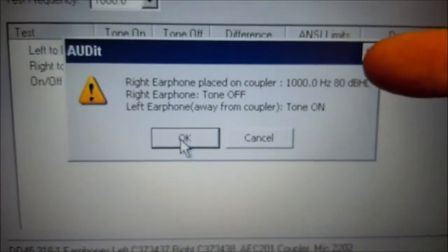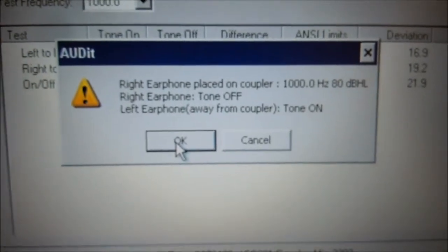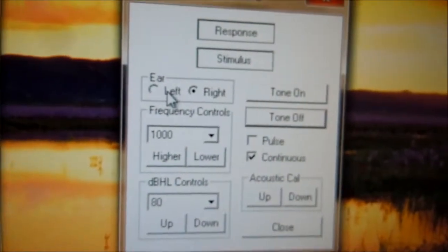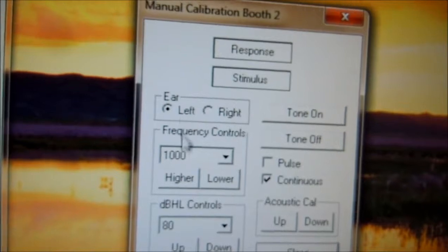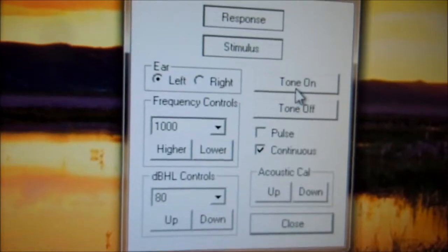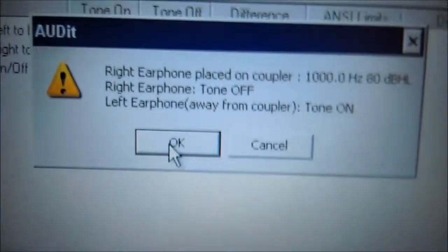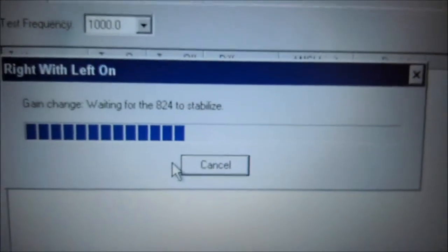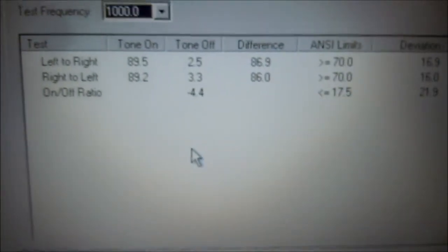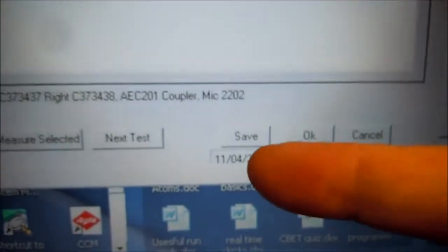We're going to make sure the right ear is on the coupler at 1000 Hz, 80 dB. We're going to turn the right earphone off and the left earphone on. We're going to select the left earphone and turn it on — left earphone is on. Come back to the audit software and press OK. We're basically just switching earphones and turning them on and off, and we're going to get our ratio — which we do. There are no red X's. We hit save and next test.